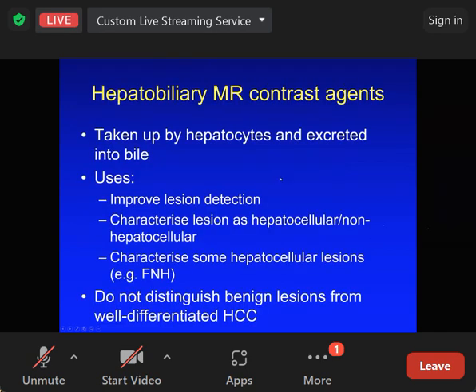Okay, then when we deal with the liver, we've got another slight complication. Firstly, I should mention that in MR imaging, the equivalent to the iodinated contrast we use in CT is compounds containing gadolinium in a chelate, and when we inject it intravenously, the tissues behave in much the same way with gadolinium as they do with iodinated contrast on CT.